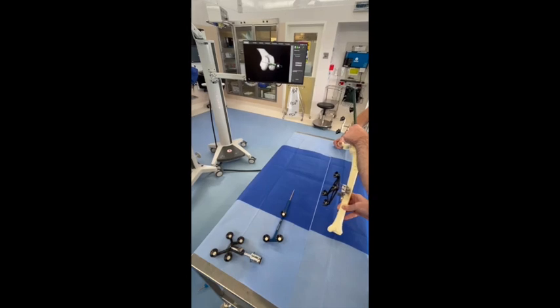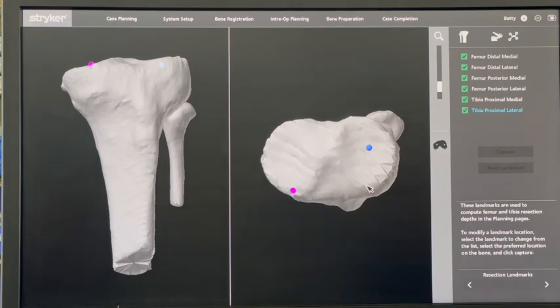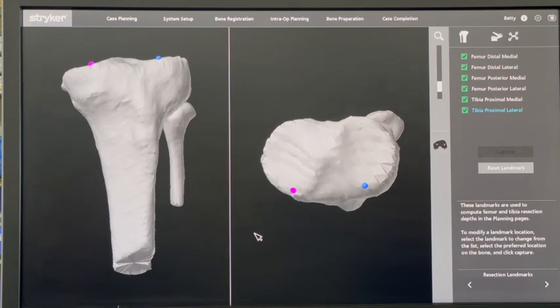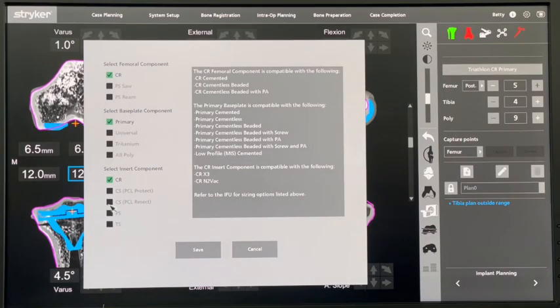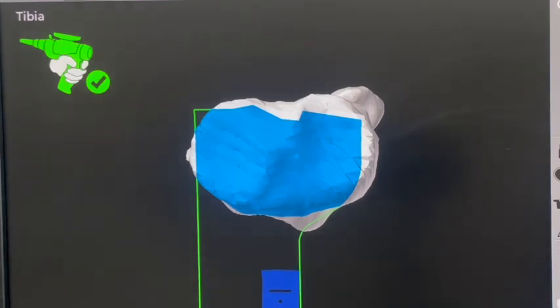Registration is performed using blue and green probes to reference off anatomical landmarks. Unlike knee replacement referencing, we have confirmed in the sawbone model that we can register only anterior bony landmarks that would be encountered in an anterior closing wedge osteotomy. Protective or haptic boundaries of the saw are set. The blade cannot move beyond this virtual boundary, offering protection of structures.